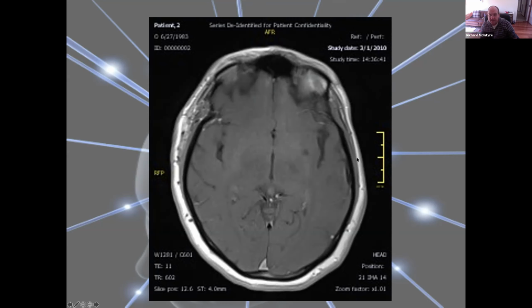Subcutaneous fat, okay, bone, and bony structure, and then of course, T1 or T2, because that's the third ventricle. Anyone? T1. T1, perfect, well done. Okay, so it's an MRI scan, it's axial, it's a T1, because we see that the water is dark.